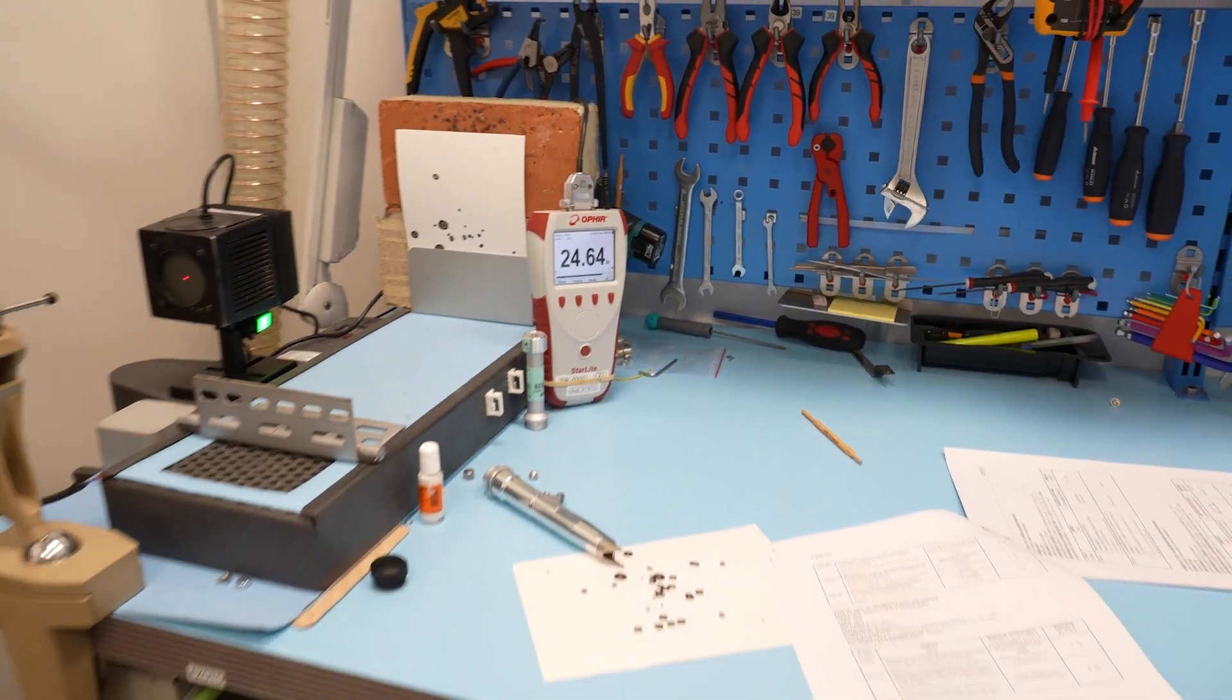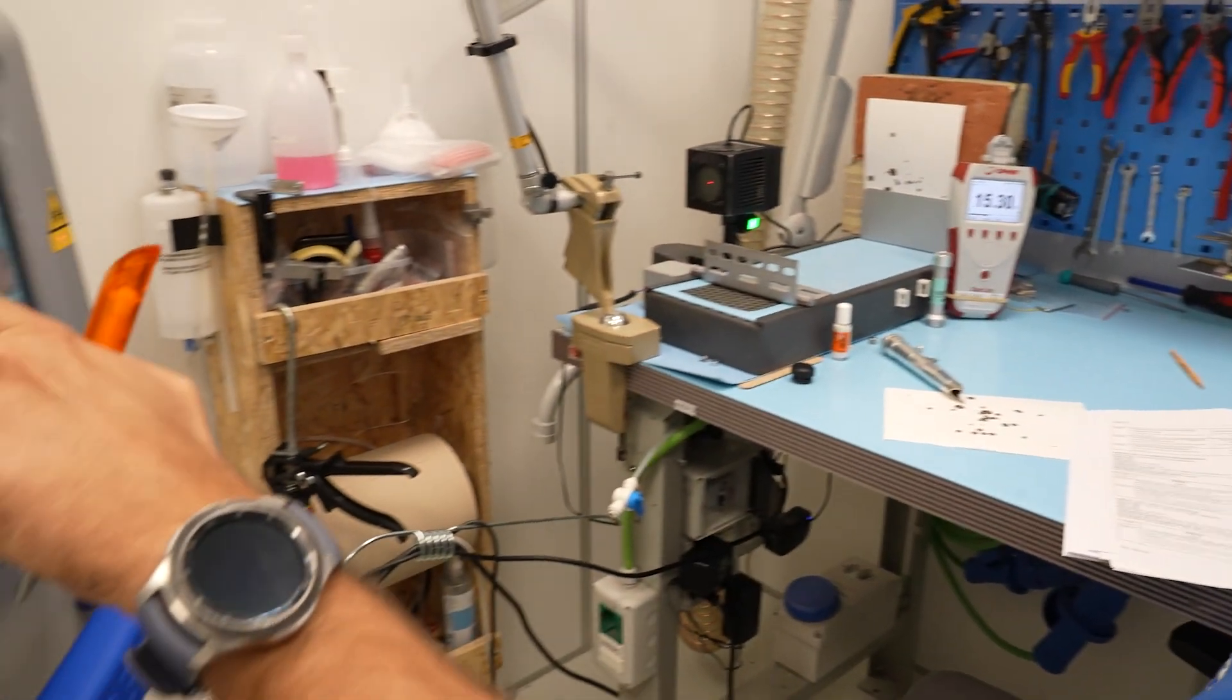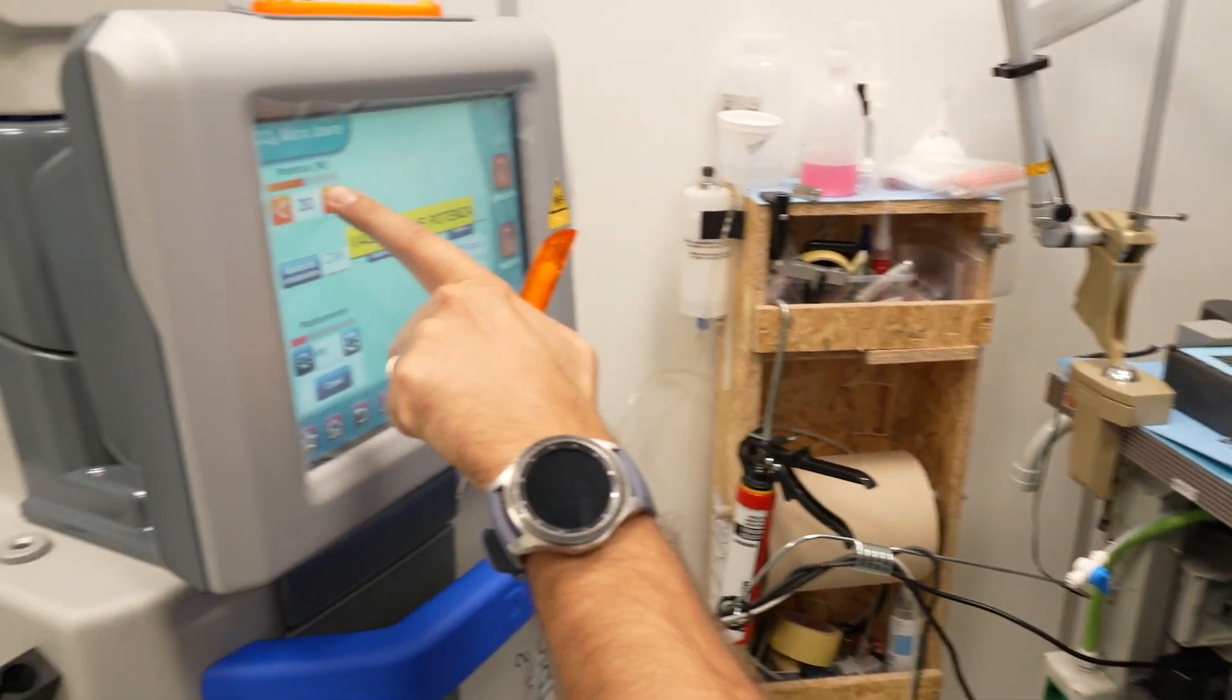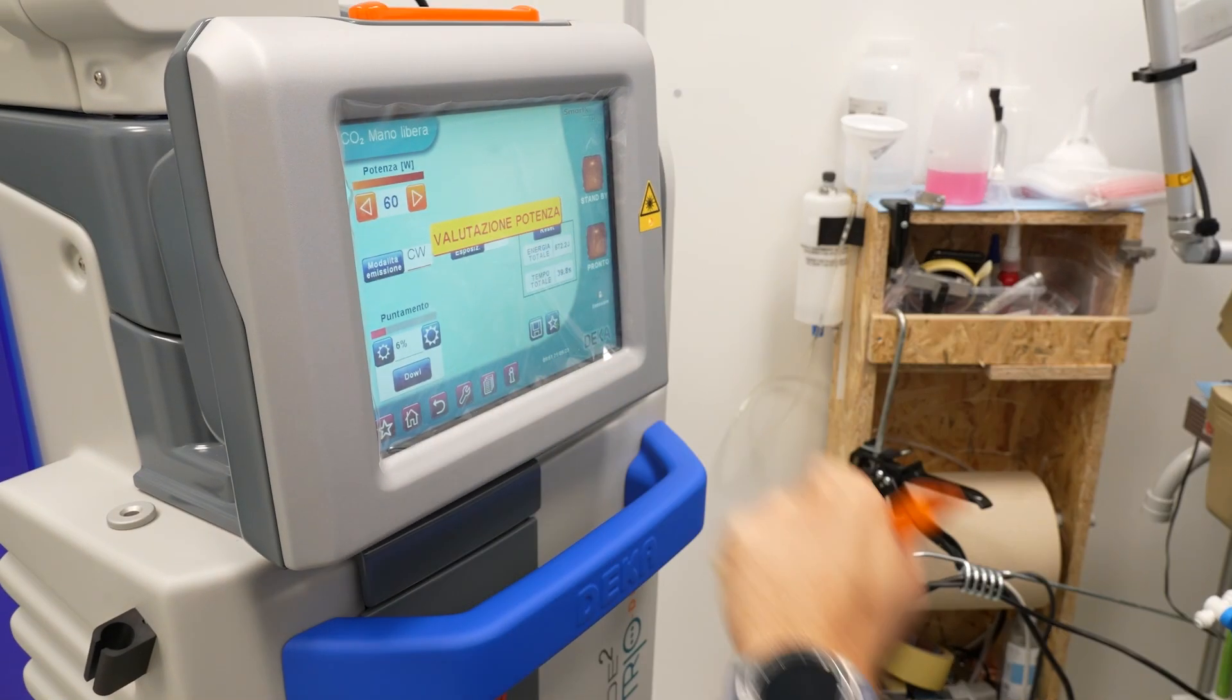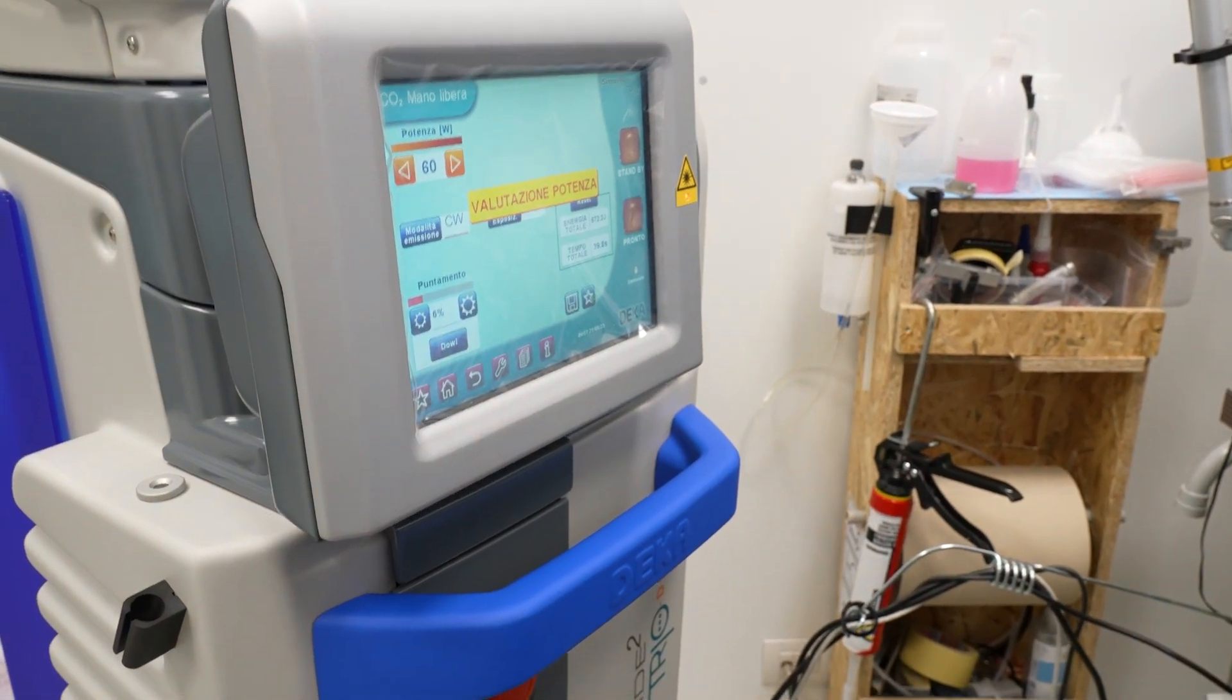The machine is set for 25 watts and the instrument verifies that 25 is the correct emittance.